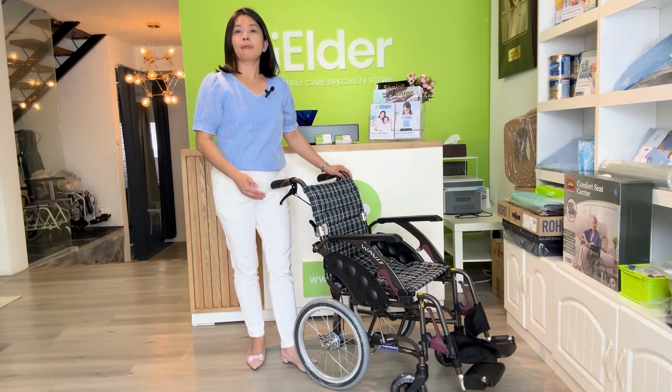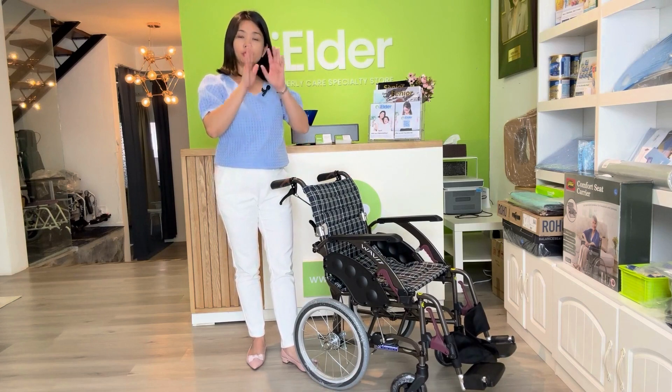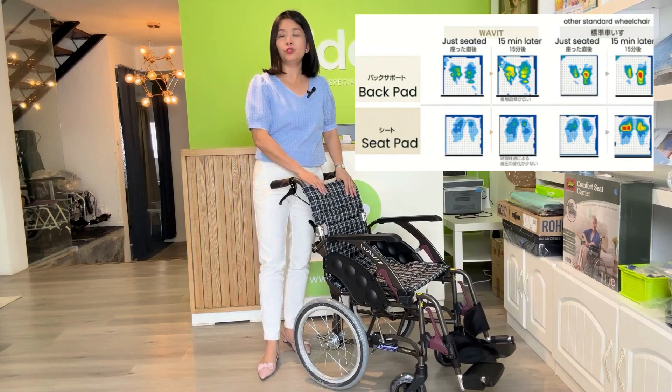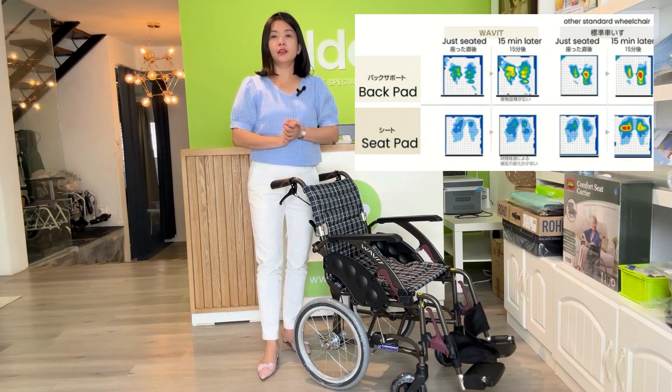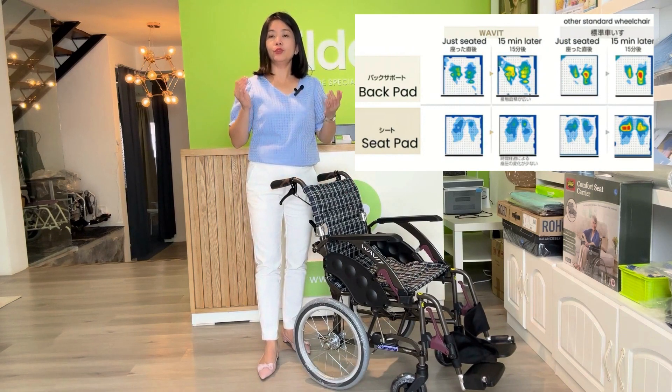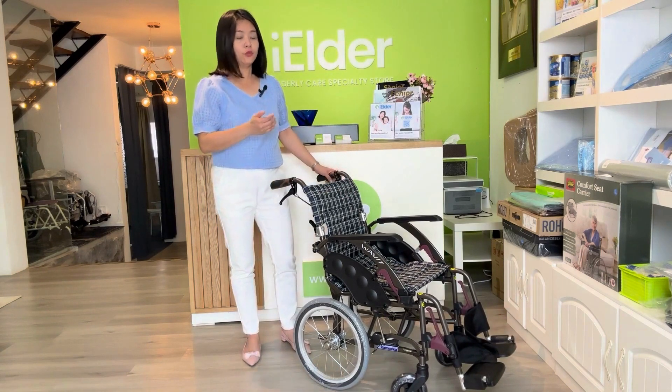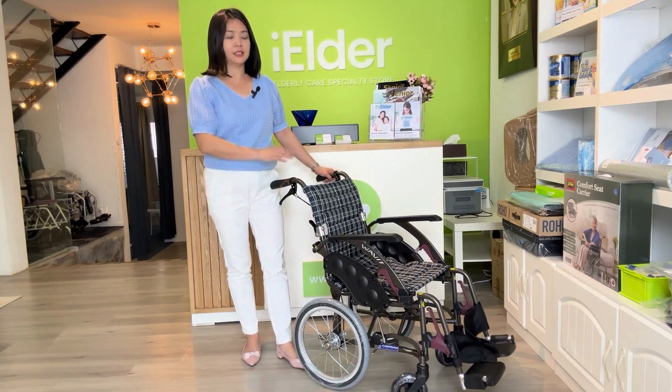With such a design and by using our pressure mapping, we can see that for those who sit in this wheelchair, they actually won't feel tired easily. So that makes sense for you to look for an economic wheelchair like this.